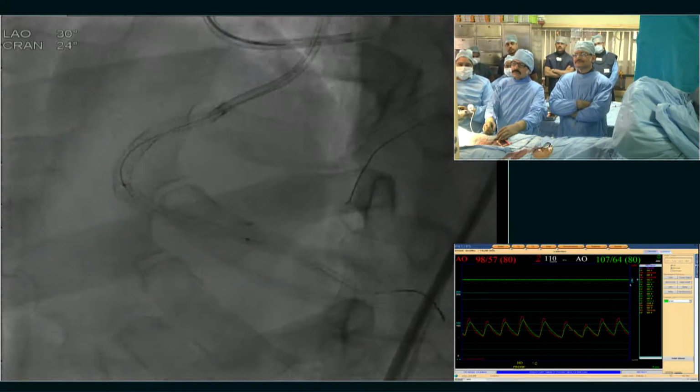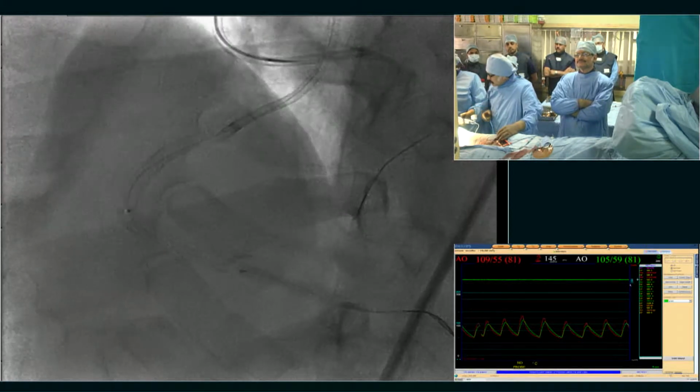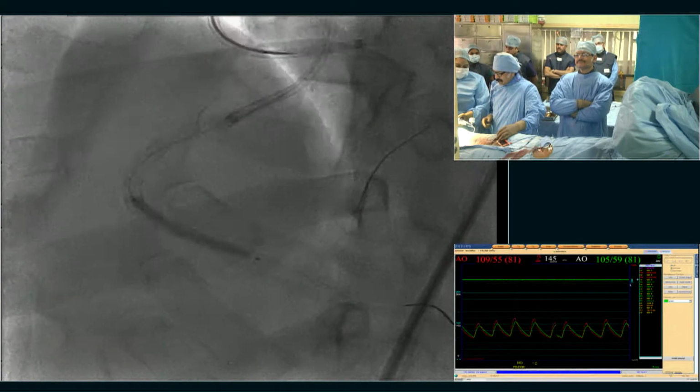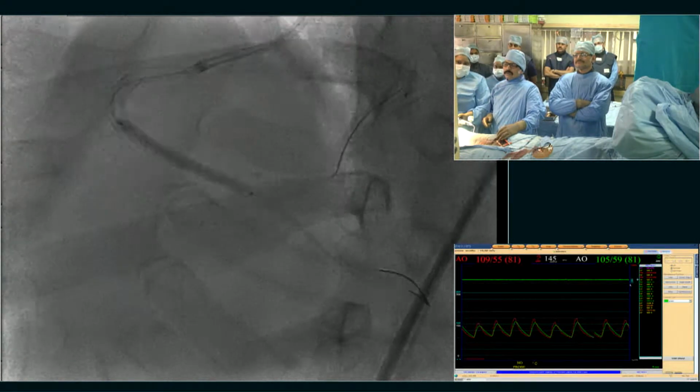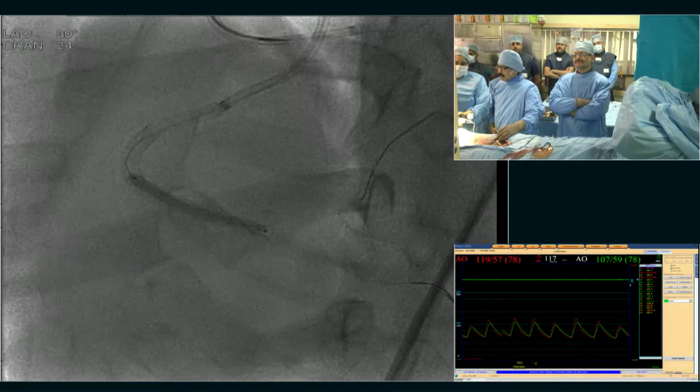This one you can. This is a 3 into 40 DEB. The nominal pressure of this is around 6, 8. You can go. 30 seconds. So they finally describe.